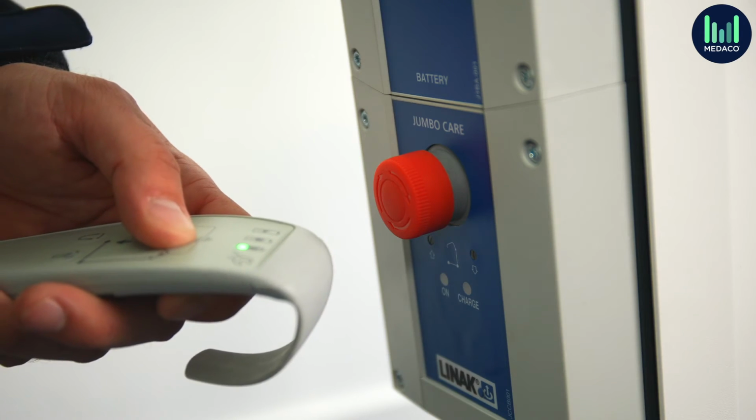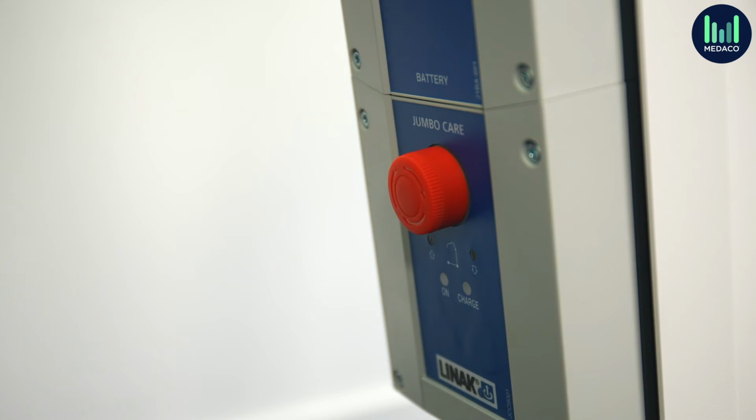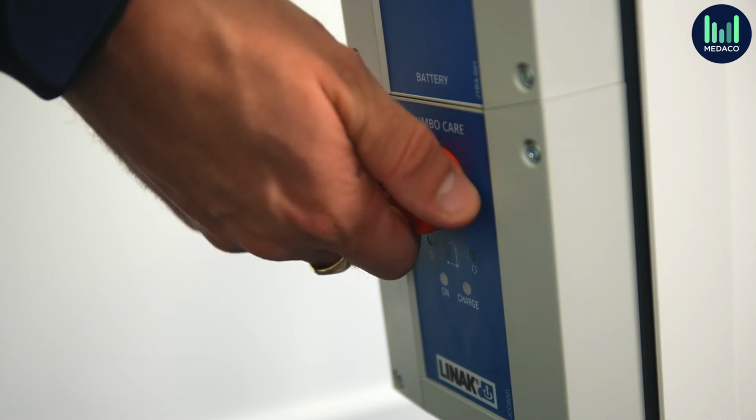The emergency stop button on a mobile hoist is designed to be accessible, so it can be used during an emergency to stop any further operation. However, due to this design, someone could accidentally push the emergency button in without realising it. This is a common reason for call-outs with mobile hoists, and we recommend checking this before requesting an engineer. If it has been pushed in, it can be easily pulled out and reset.